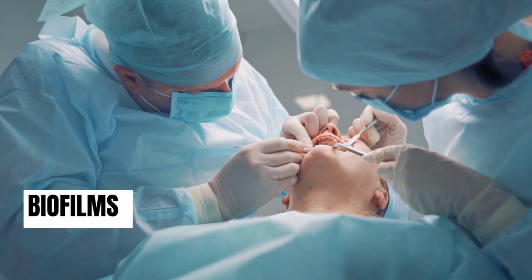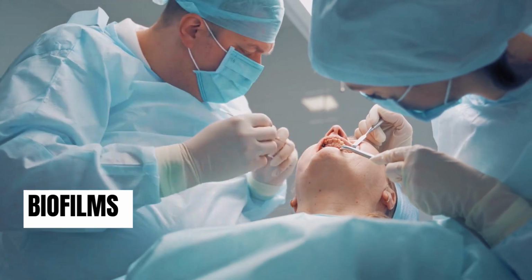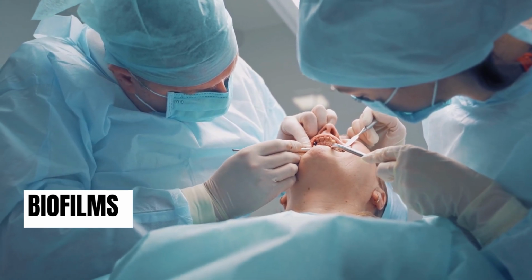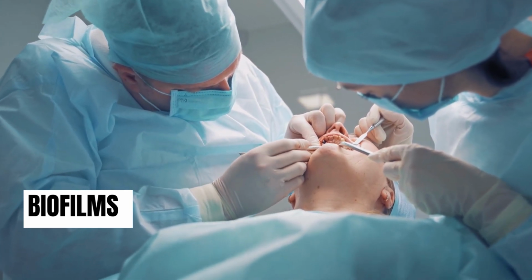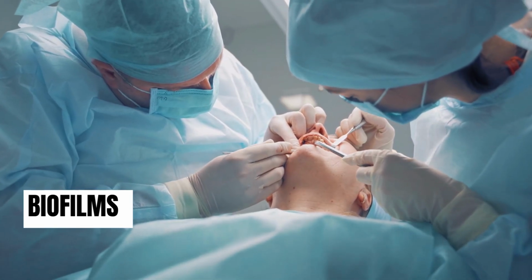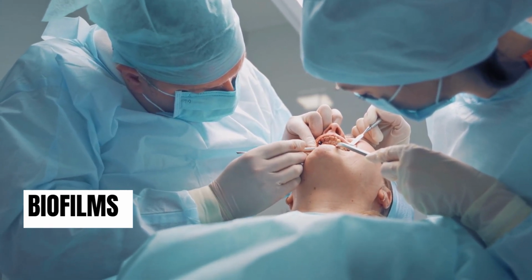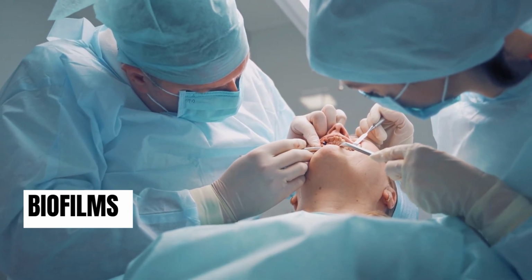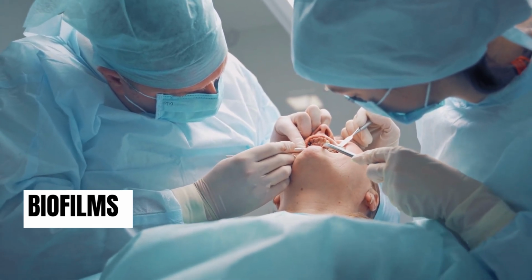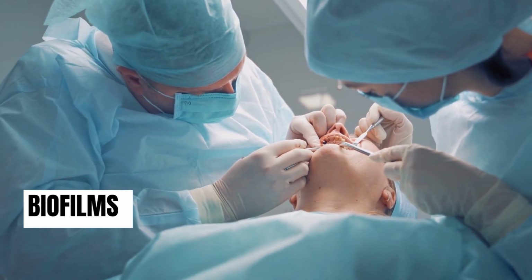The clean and dry handpiece harbors few bacteria, but contamination of the handpiece lumen with salivary bacteria occurs during its use. If you wipe the outside of the handpiece with disinfectant, it does not eliminate the risk of potential cross-infection because the lumen continues to harbor the pathogenic bacteria. So, water samples from the dental units are often found to be heavily infected with bacteria, and some of them are of oral origin that come from the oral cavity of the patients, which colonize the water pipes of the unit.